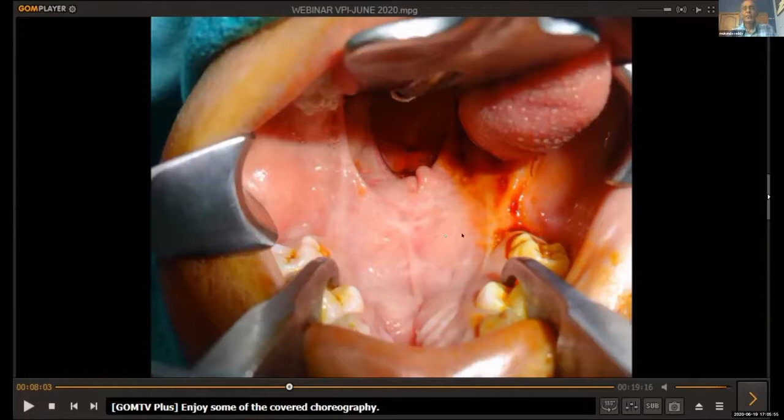Okay, thanks, Savita. This is the picture of the palate of this child. This child, I myself operated on, seven years before the VPD assessment. The surgery was done in 2014. I have selected three or four patients where I can give the voice sample, the picture of the palate, the nasal endoscopic findings, what decision was made, and the subsequent webinar which you are planning about management. I'll probably be able to show the same patients with post-op endoscopy and voice sample. So that will complete the picture.